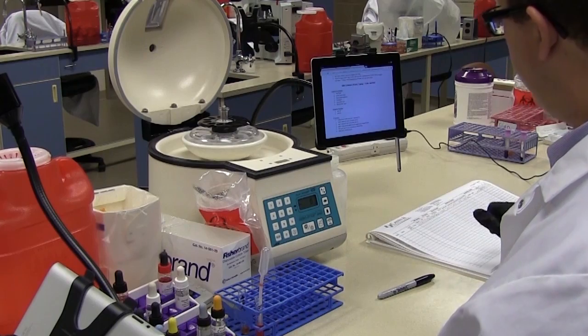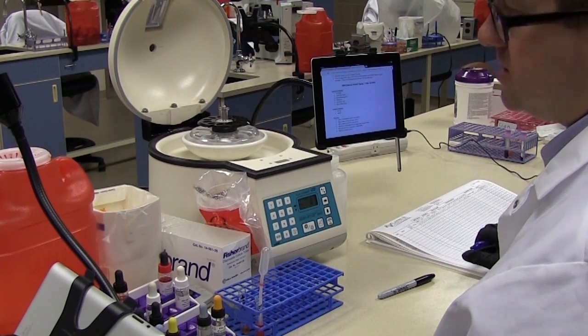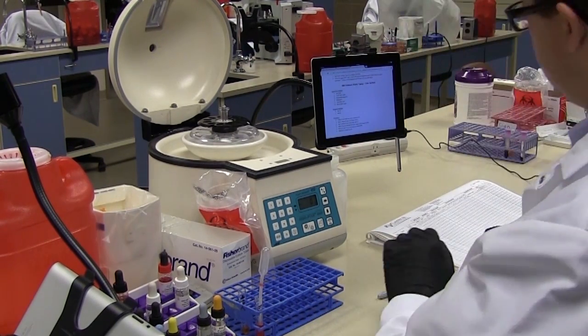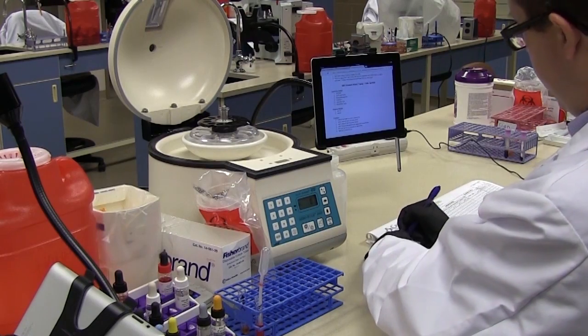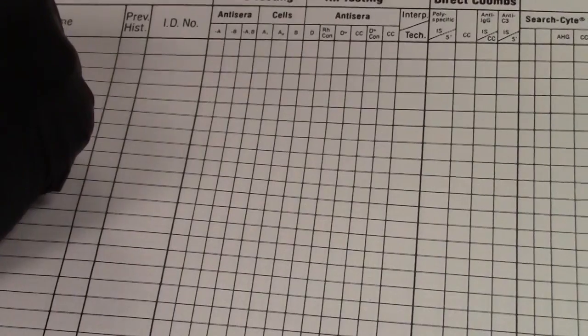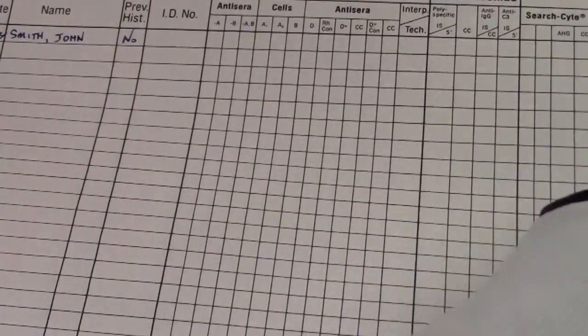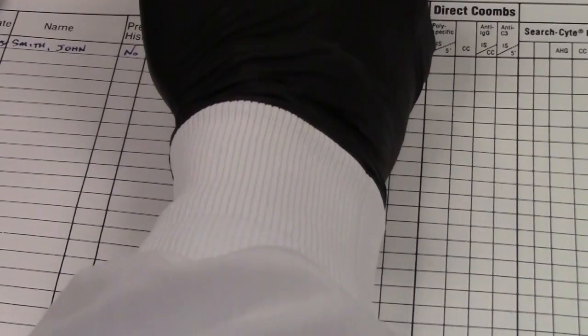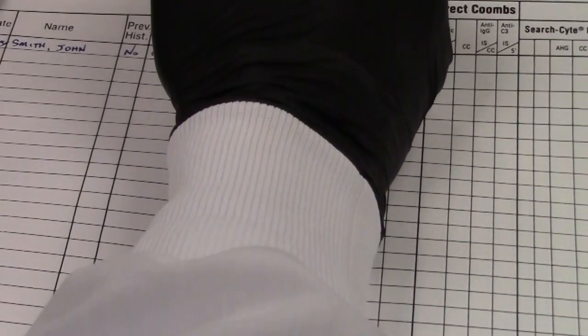So on our results sheet or our results log we're going to go ahead and record the patient information. So today is 10, 31, 14. Our patient is last name Smith, first name John. Previous history, no patient doesn't have any previous history. ID number 1, 2, 3, 4, 5.